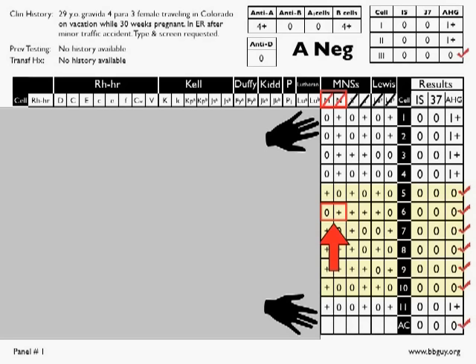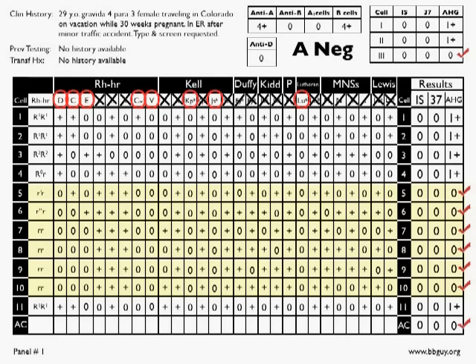We can move along. You go through the panel in a vertical way, in the same manner, and you're going to end up with the exact same set of rule outs that you would have gotten if you do things in a horizontal manner. Again, for me, I find that it happens more quickly, I should say, by doing things vertically. Now, we'll go back to this slide that I showed you before that has multiple crossouts. So please don't let that confuse you. I'm just showing you different ways to look at this and different ways to go about it.